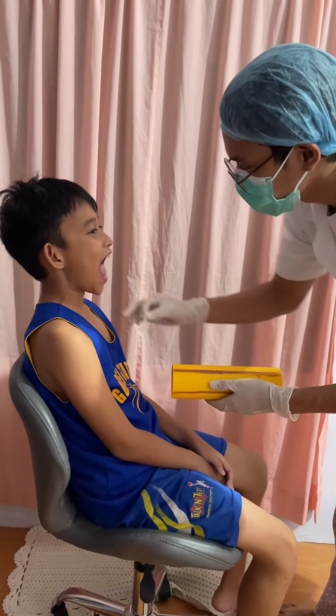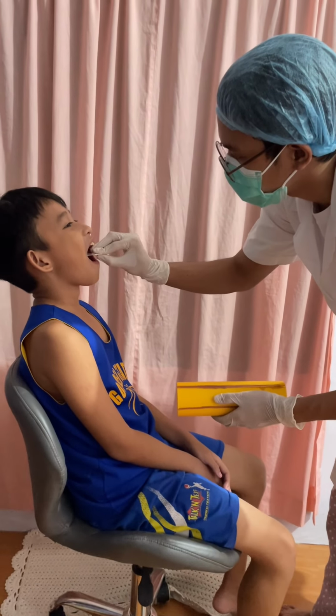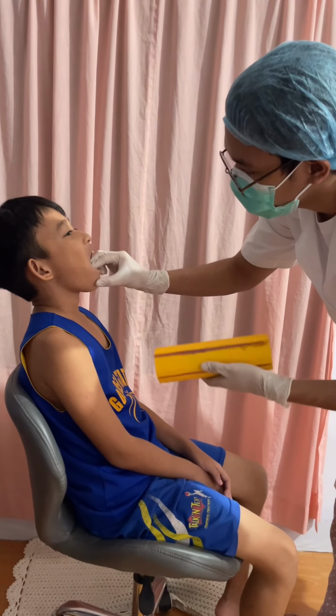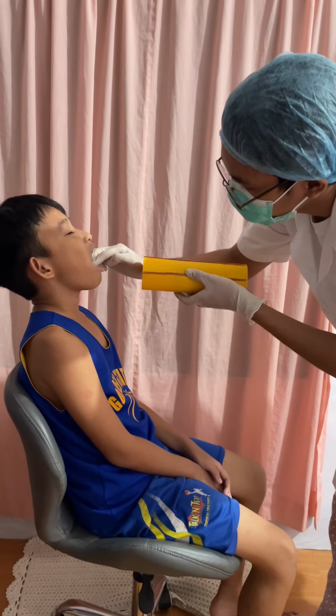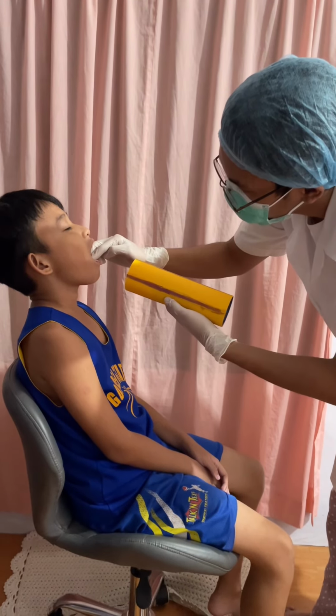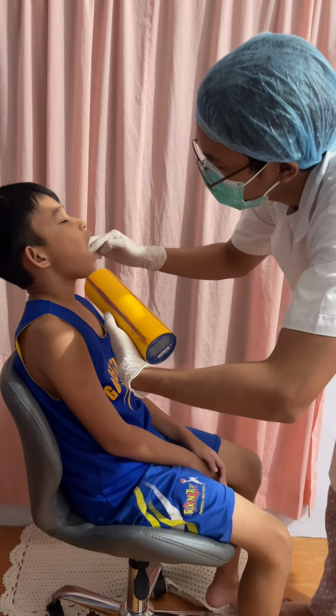The steps for this demonstration are pretty much the same as the first demonstration, but with a slight difference. First is the orientation of the film. We will be placing the film horizontally for posterior teeth. Second, the cone should be at a level half an inch from the lower border of the mandible instead of placing it at the level of the ala-tragus line.